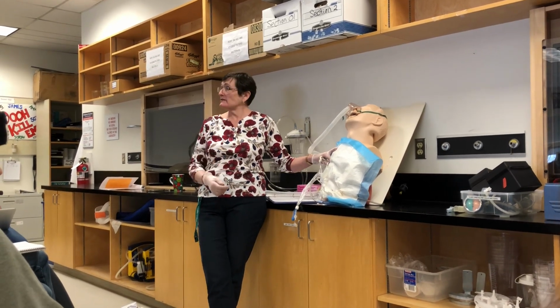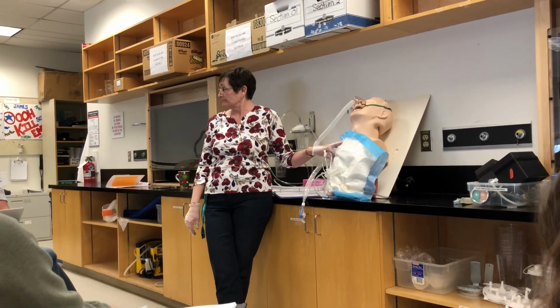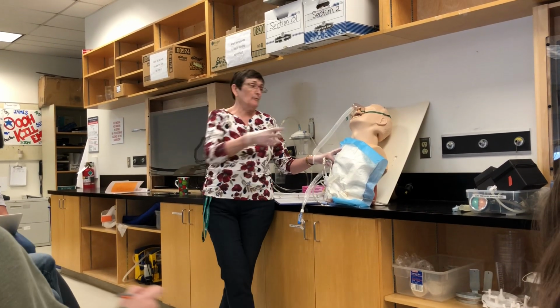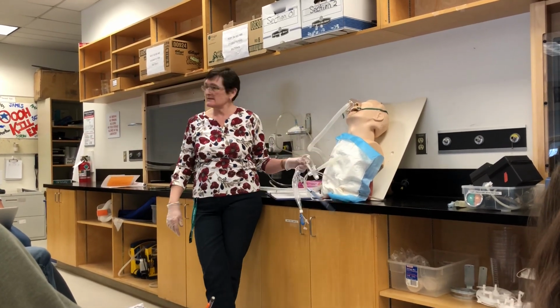So we're watching, and then after about 20 to 30 minutes, we do a blood gas, or a draw sample. They most likely will have an art line in. So we'll do gases and see where we're at.